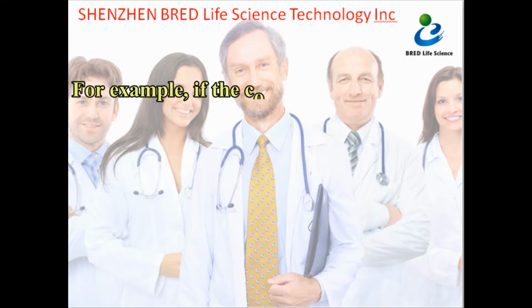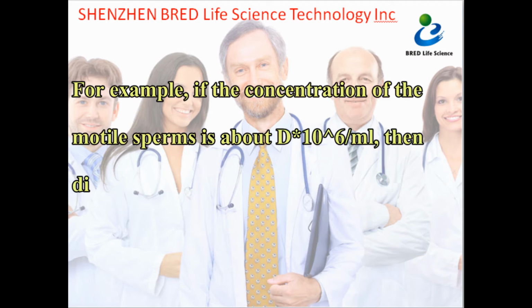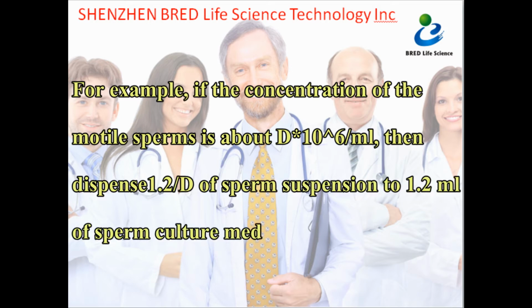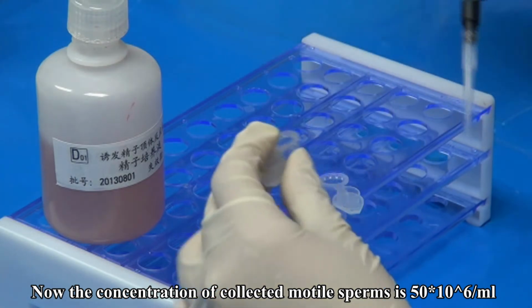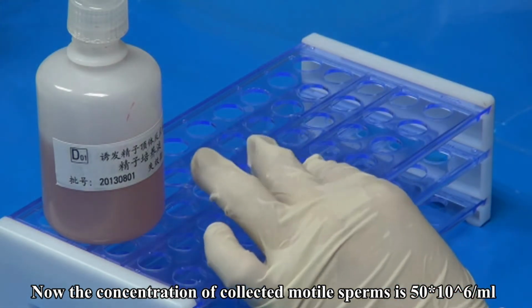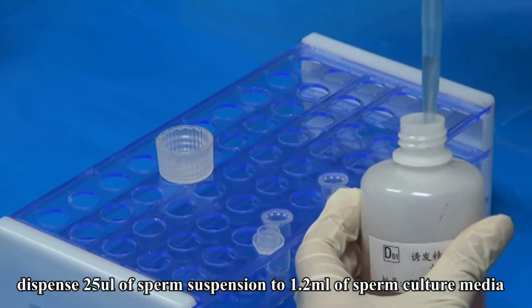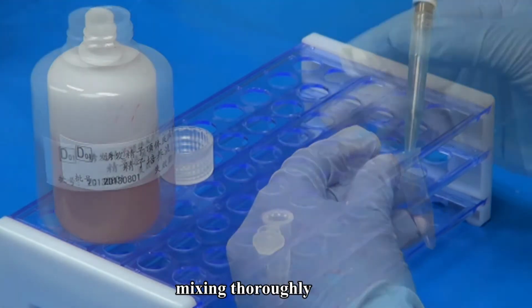For example, if the concentration of the motile sperms is about D times 10 to the 6th power per milliliter, then dispense 1.2 per D of sperm suspension to 1.2 milliliters of sperm culture media. Now the concentration of collected motile sperms is 50 times 10 to the 6th power per milliliter. Dispense 25 microliters of sperm suspension to 1.2 milliliters of sperm culture media, mixing thoroughly.